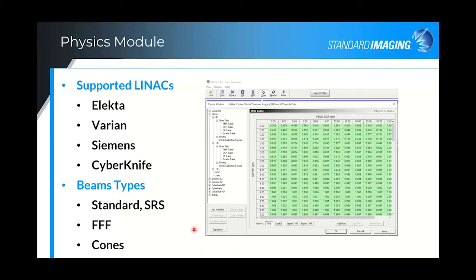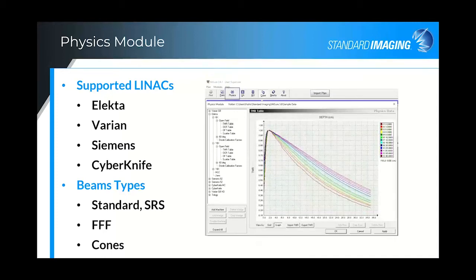And then here you can review, of course, the TMR tables, both in a graph as well as in tabular formats. And so both are there so that you are able to review the data that you have input and spot any inconsistencies before approving and validating your model.